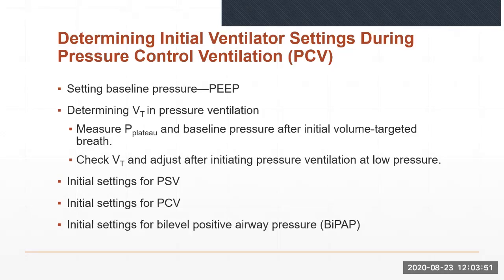Each of these modes has specific controls that are set by the operator. Less frequently used pressure targeted modes, such as pressure controlled inverse ratio ventilation and airway pressure release ventilation, will be reviewed as a separate topic in a separate lecture.